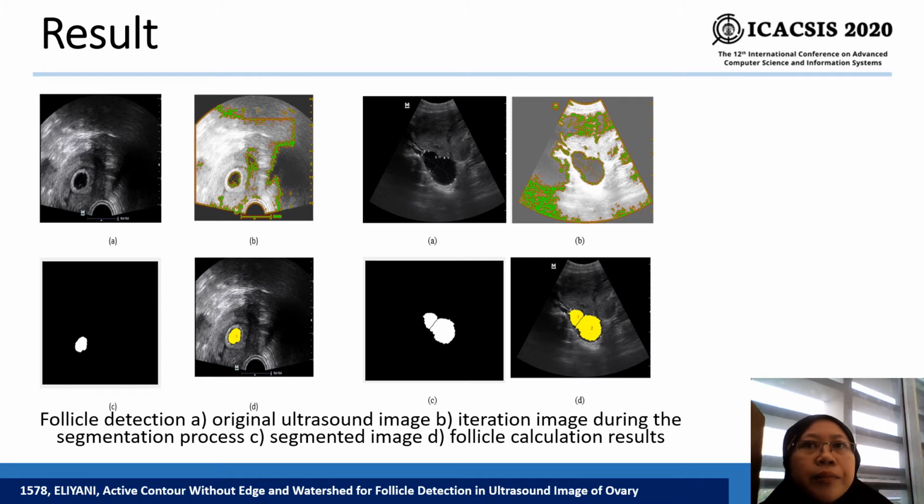Result, follicle detection. The proposed segmentation method provides an automatic method using active contour without edge and watershed segmentation.